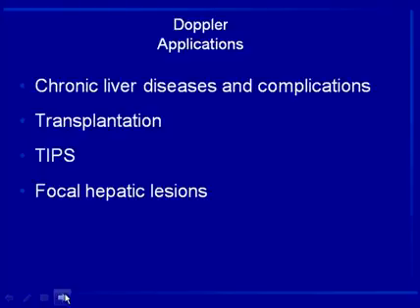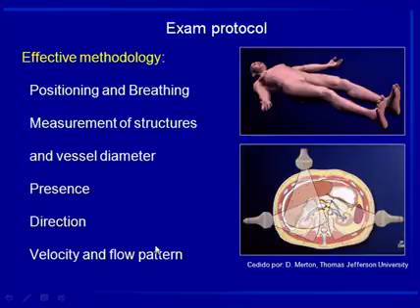Doppler applications. You can use Doppler for the evaluation of chronic liver disease and complications, evaluation of liver transplants, evaluation of TIPS, and focal hepatic lesions. Exam protocol.